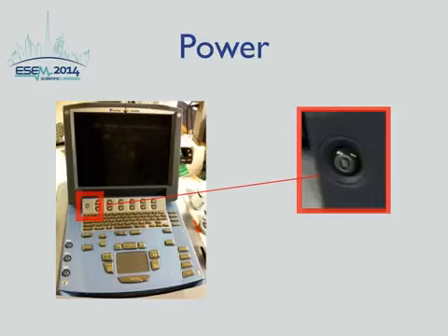Make sure that the ultrasound machine is actually plugged into electricity, because with most ultrasound machines the battery life is short, and if they're not plugged in, even if you try to switch the power button on, it's not going to turn on. So make sure it's connected and make sure that you know where your power button is to switch this ultrasound machine on.